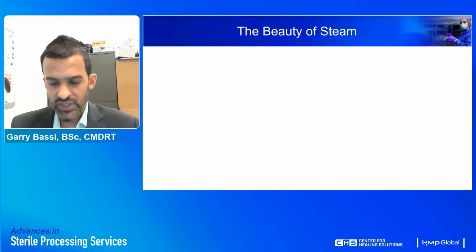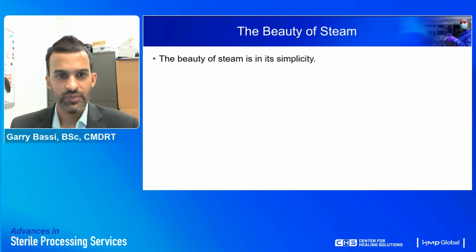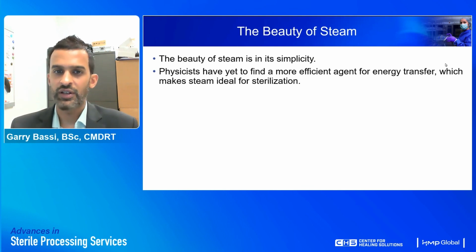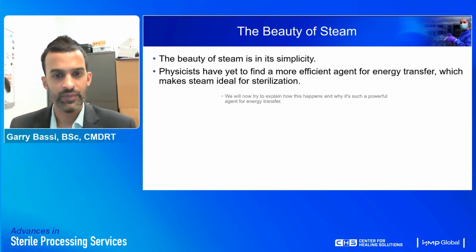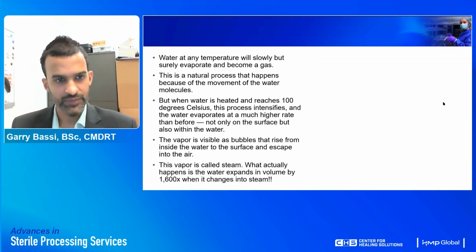So let's talk about steam. The beauty of steam lies in its simplicity. Physicists have yet to find a more efficient agent for energy transfer, which makes steam the ideal medium for sterilization. So we will now try to explain how this happens and why it's such a powerful agent for energy transfer.